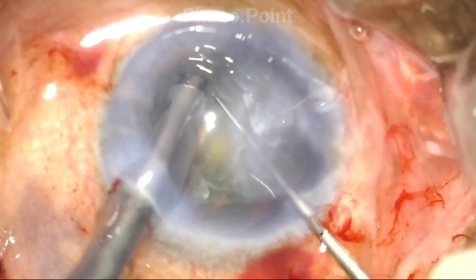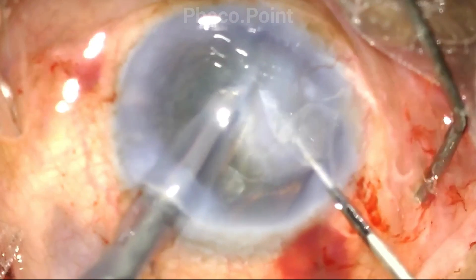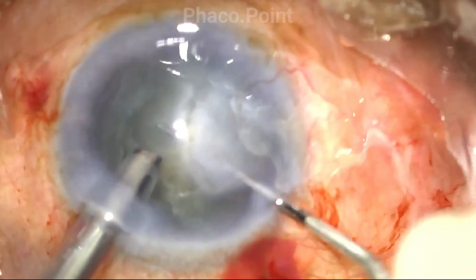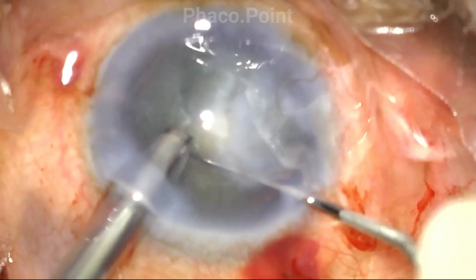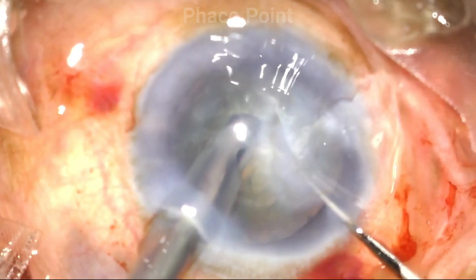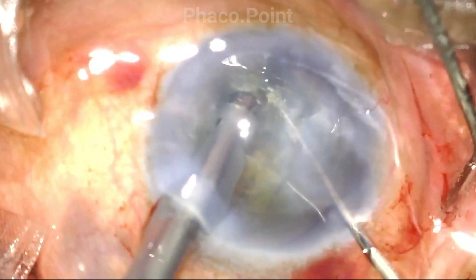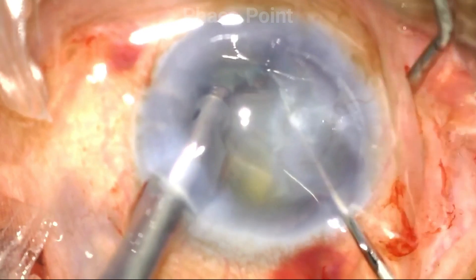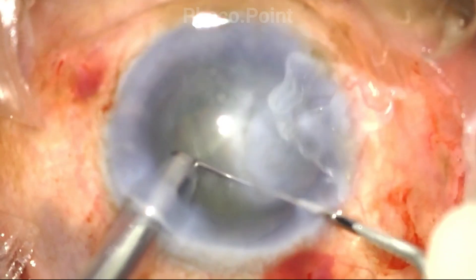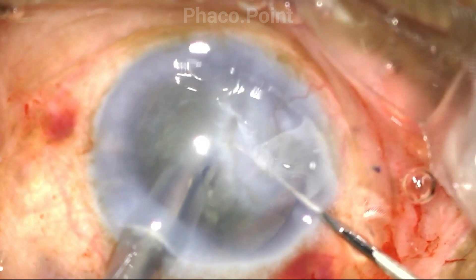I'm able to split the nucleus into two hemi-nuclei. Once done, I turn the nucleus around and start to chop the individual hemi-nuclei into smaller fragments. Please note how I create the chop slightly on the left where I actually have visibility, just beyond the corneal opacity.